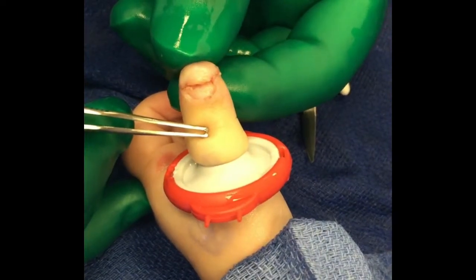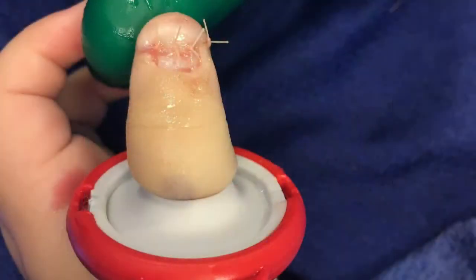Once that's been performed, you can get an idea of how the fingertip goes back together. Absorbable sutures should always be used in children, and three or four sutures will bring back the pulp and the nail bed nicely.